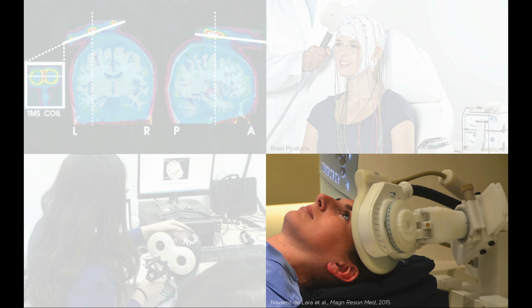By far, the most difficult is to perform TMS in an fMRI scanner, and there are a number of technical challenges in combining TMS and fMRI, mainly due to the large magnitude magnetic field of the scanner and the large magnitude magnetic field produced by TMS.